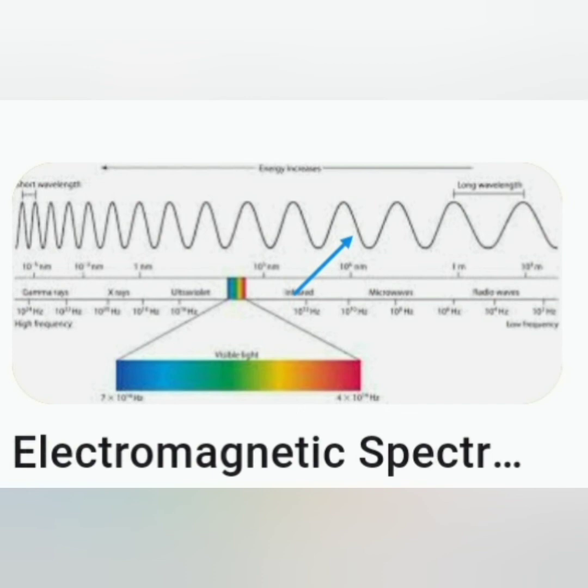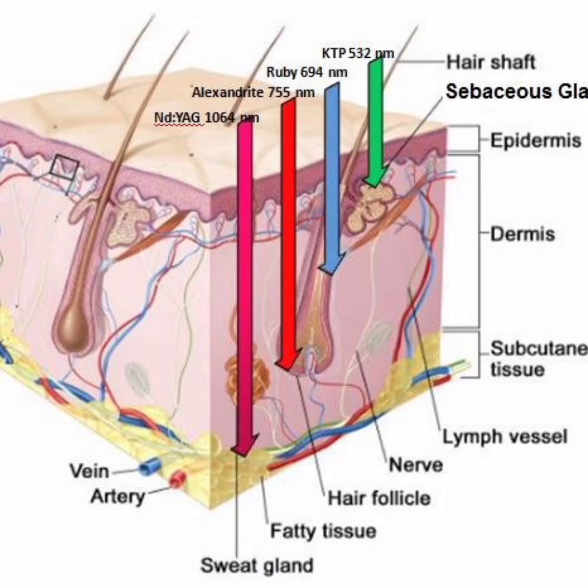When you set the settings, these enhanced capabilities are used to target the larger and deeper hair follicles and spare the superficial melanin and darker skin type by using longer wavelengths and larger beams for deeper penetration, combined with longer pulse duration to avoid epidermis harm and target the hair follicles.